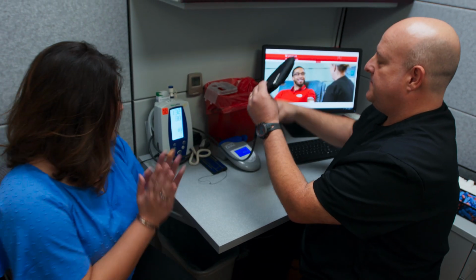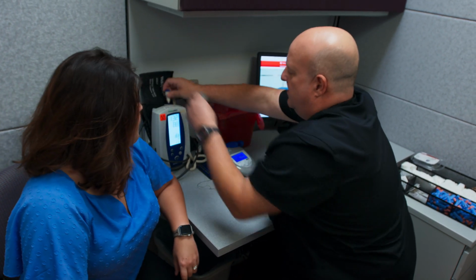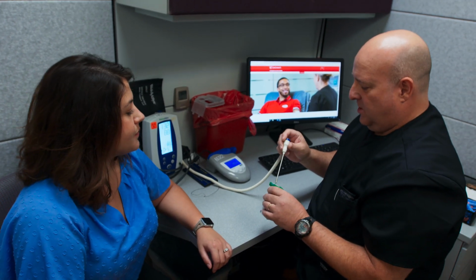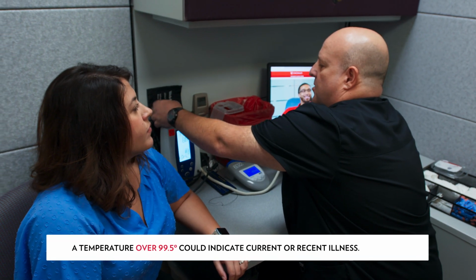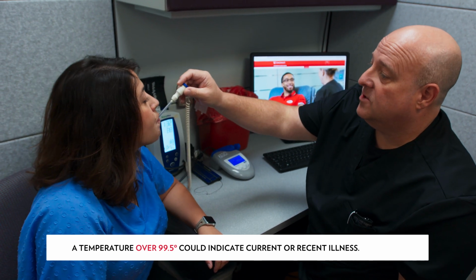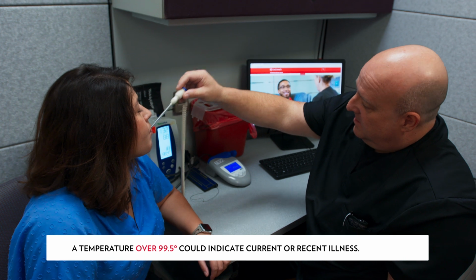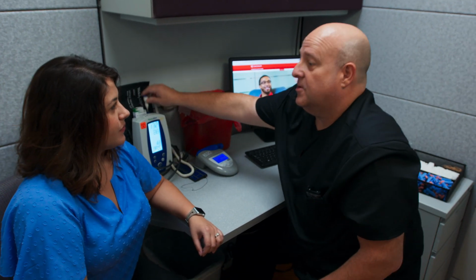Perfect. Excellent. One more thing to get here, and that's your temperature. And what's the healthy range for that? 97.2 is about where it's at. Our criteria is a little bit different. We don't want to draw you over like 99.5 just in case something is going on and you might be getting sick or getting over being sick. Okay. Under your tongue, thank you. 98.4. Excellent. So all your vitals are within range and you're good to go to donate today.